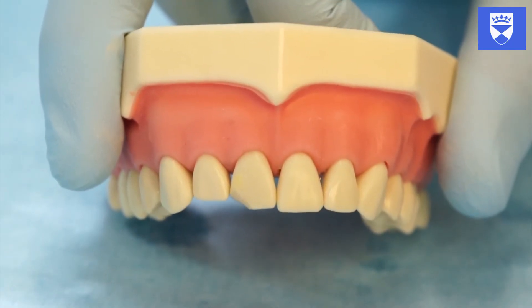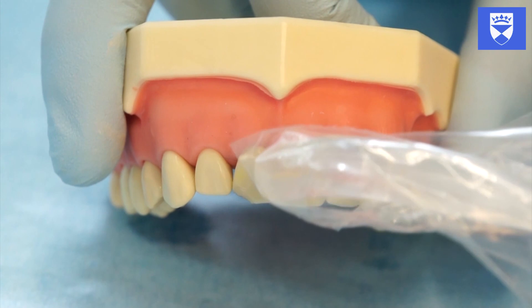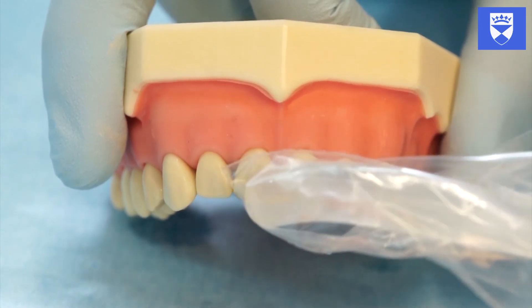Light cure the composite. Once you are happy that you have performed a suitable composite bandage, remove the rubber dam and assess.